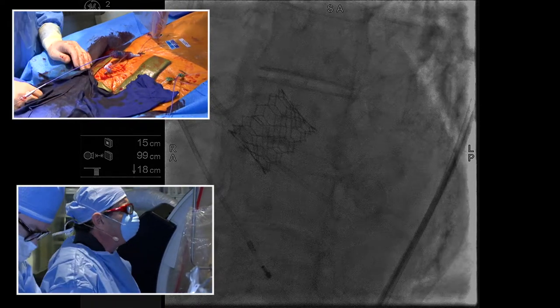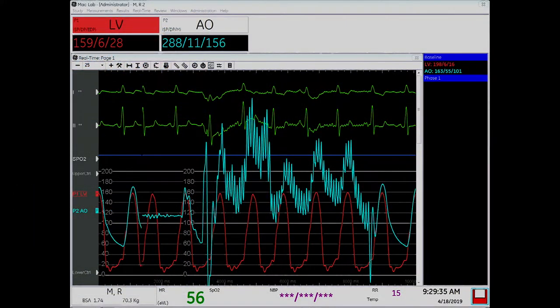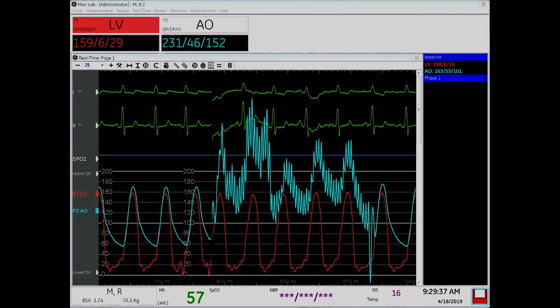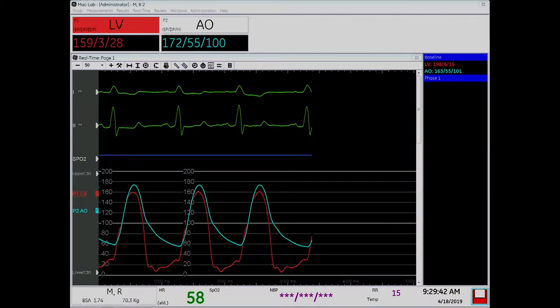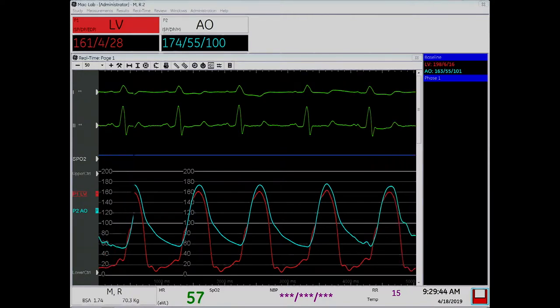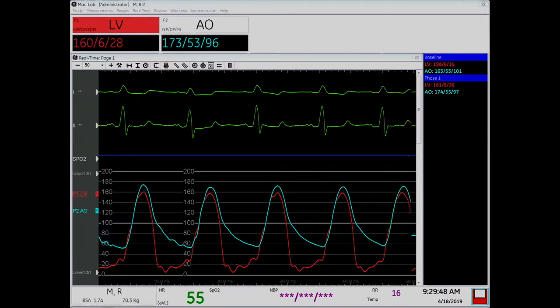Remember I said I want the blue line and the red line to overlap, which that looks pretty good, right? 23, yeah. 23. So you see the difference there. Now, the other thing we're looking at is the diastolic pressure, which is 60, and it was 55. So that's probably gonna be okay.